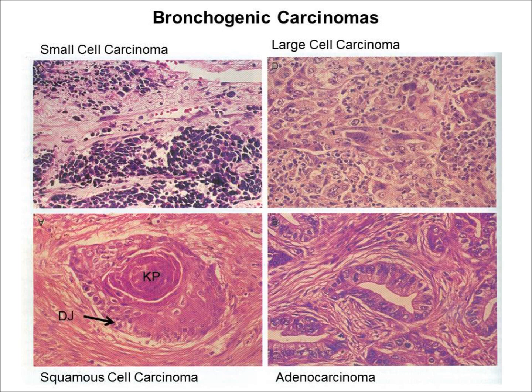Well-differentiated forms of these tumors often display distinct desmosomal junctions between the cells and can form keratin pearls as shown here. In the lower right quadrant is adenocarcinoma, which has a gland-like appearance and may contain mucin in their lumens. And finally, in the upper right-hand quadrant is large cell carcinoma. This is also known as undifferentiated lung cancer because of its anaplastic nature.